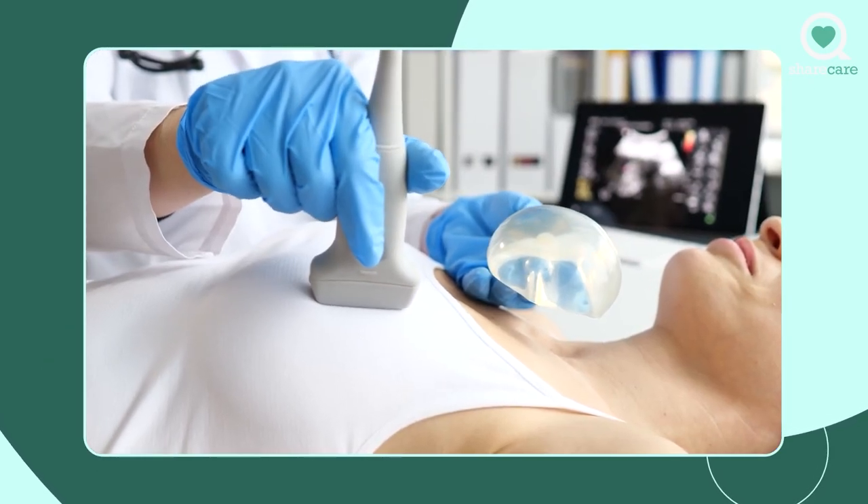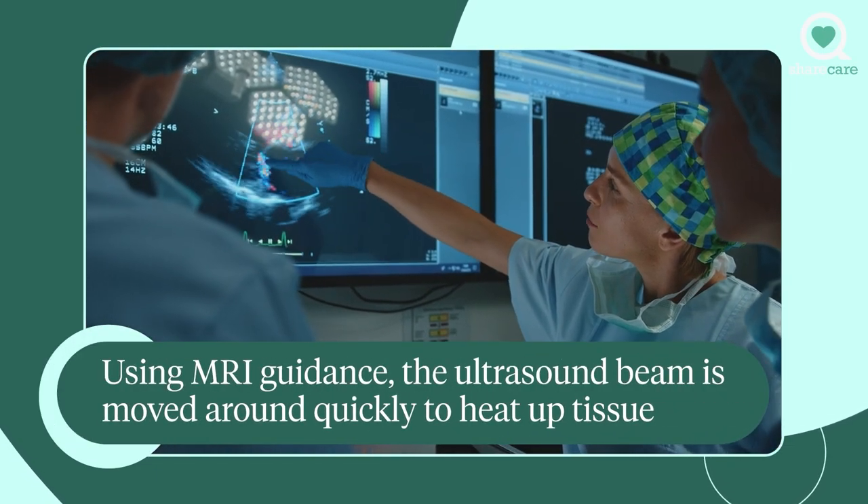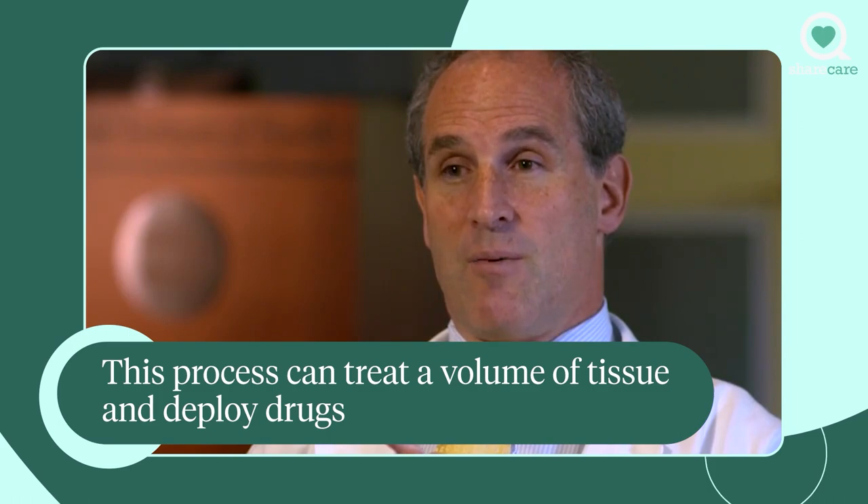We can then move that rice kernel very fast around using MRI guidance. We can measure the temperature of the tissue that we're heating up, all non-invasively without touching the patient, and we move that little rice kernel around in the body to treat a certain area. We can treat a volume of tissue with temperature elevation and kill tissue that way.